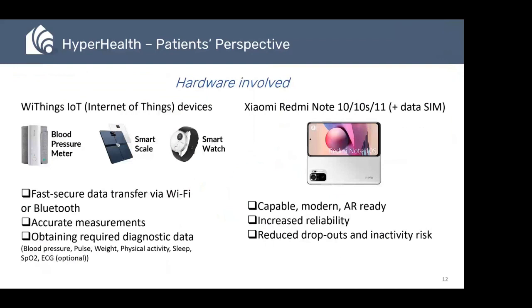The hardware involved in the project is, as I already mentioned, the IoT devices provided by Withings, that can be connected either via Wi-Fi or Bluetooth, that provide accurate measurements, are medically certified, and can also provide another important set of, let's say, secondary statistics that are not considered relevant in the clinical platform, but that can be downloaded as a dump of data anyway.